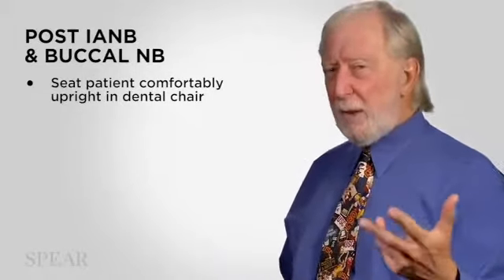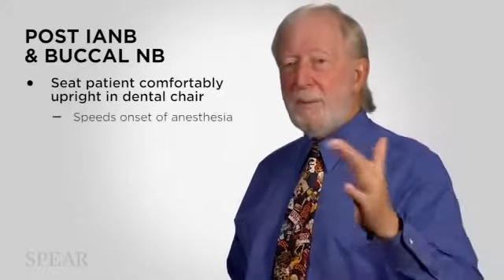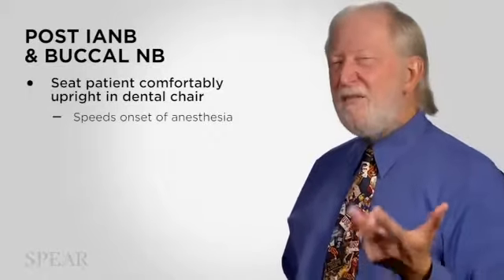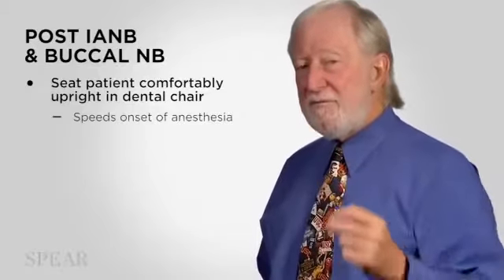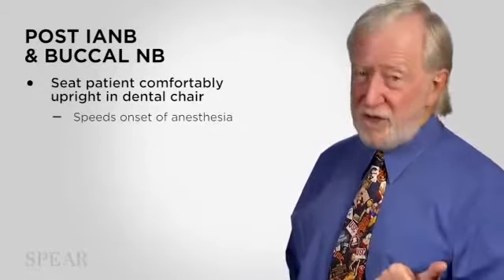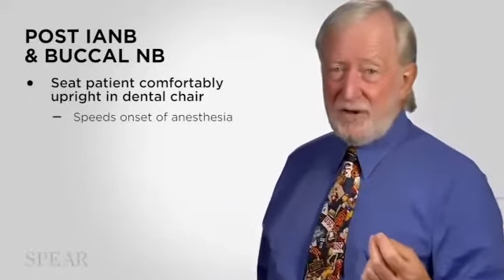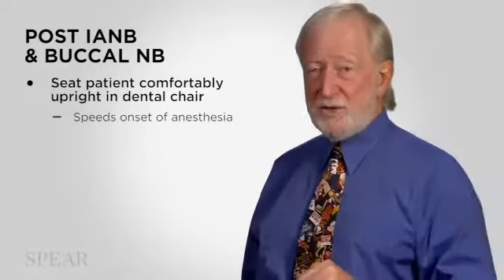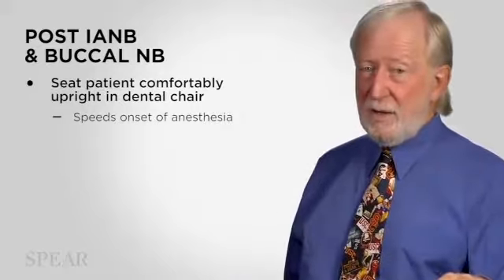If that patient is still lying down, as they almost always are, I simply sit them up. I sit them up comfortably. I walk away for 5 or 10 minutes, and I come back. And invariably, they're number. They may still not be numb enough for treatment, but they're number. So number one is positioning. And like I said, it seems to speed the onset of anesthesia. And also, it prevents the fainting when you lay the patient down for the injection. Not just for the IA, but for any injection you're giving in a patient.